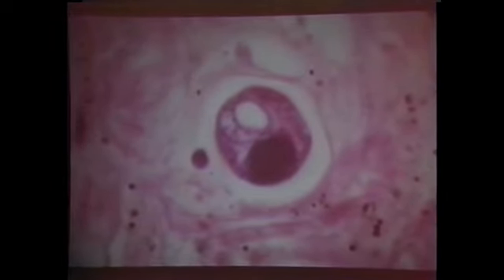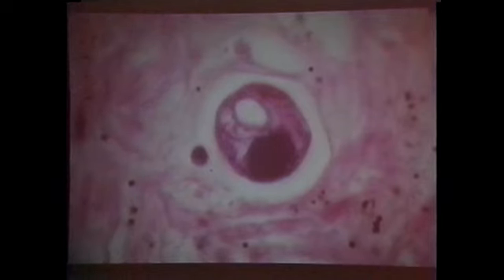The female has 1 genital tract, as opposed to what I told you before. It reflexes as the ovary right here, so if you get a longitudinal section, and they usually lay uninucleate eggs, and they're tiny little things, which the egg embryonates in tissue and forms larvae, which grows up into female, and you have large numbers of organisms.